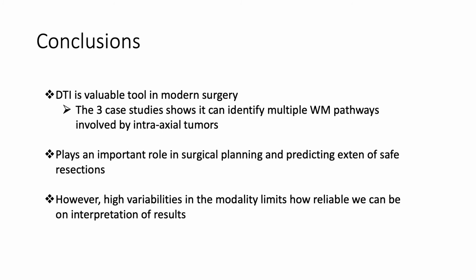However, there are also high variabilities in the sophistication of this modality, which limit the interpretation of results, thus warranting more studies to optimize and simplify fiber tracking. So the future of the field is reliant upon identifying more precise algorithms that distinguish between white matter tracts and tumor cells. Progressive improvement in scanning as well as software-based methods of fiber tracking can overcome these limitations and help neurosurgical planning. Thus, the field is turning towards this and more studies are being conducted.